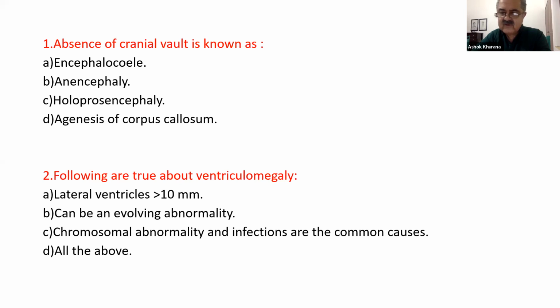Because here, for instance, ventriculomegaly is the most classic example, where you could have a mild ventriculomegaly and yet have a completely normal outcome. So we do not want to destroy healthy fetuses, and we want to give each fetus an optimal outcome. Which means that with mild ventriculomegaly, MRI normal, infection screen normal, and genetic amniocentesis normal after doing a microarray, the prognosis is likely to be excellent, and likely to be good in over 90 to 95% of cases.